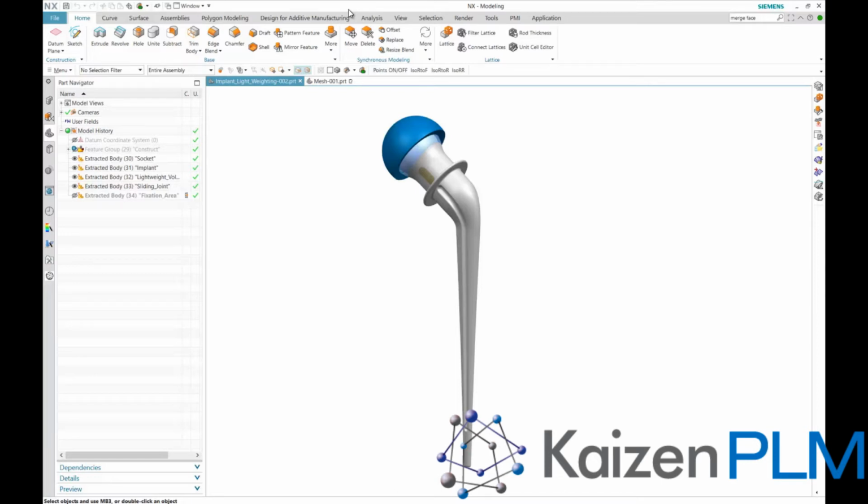In order to demonstrate the general enhancements made to Lattice, we will be using a model of a hip implant. We will be adding some lattice for mixed reasons, such as making the implant lighter and at the same time reduce material. We will also add some lattice to fixate a joint surface layer of polyethylene to the implant.